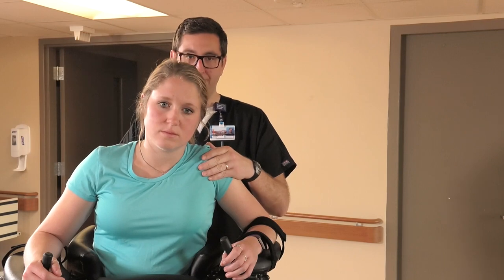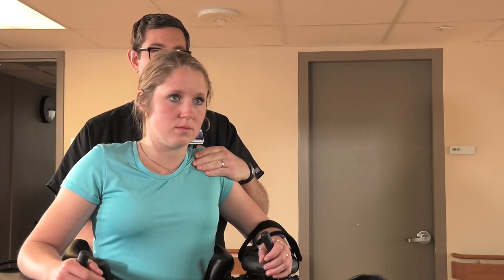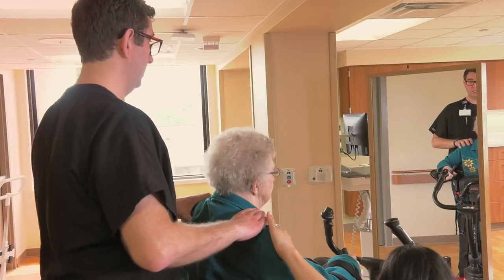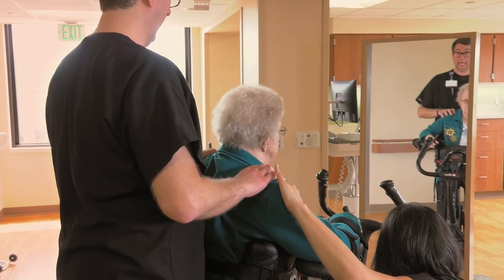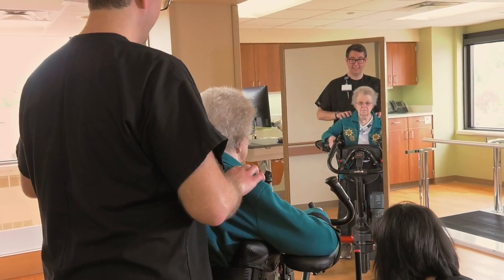The assistant standing behind the patient can facilitate back extension through the shoulders with verbal and tactile cues. Trial standing tall for one minute with as much physical assistance as necessary to maintain correct posture.